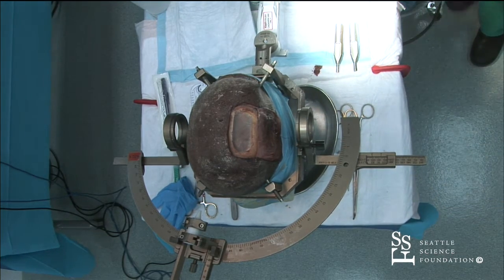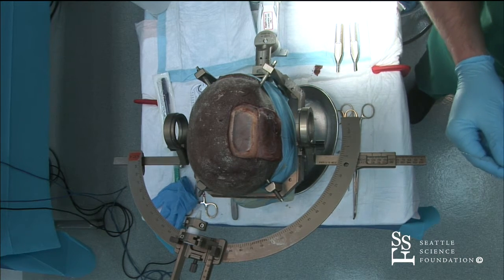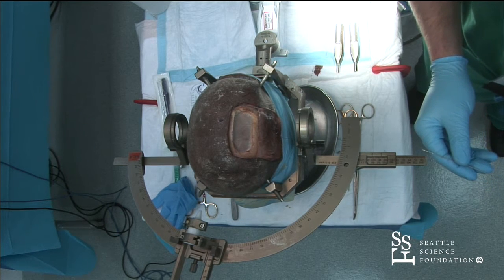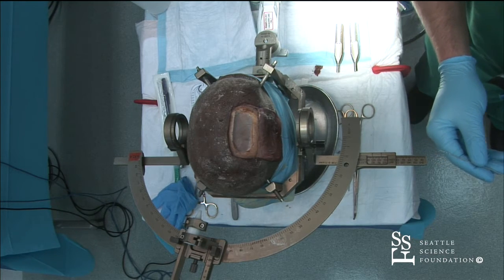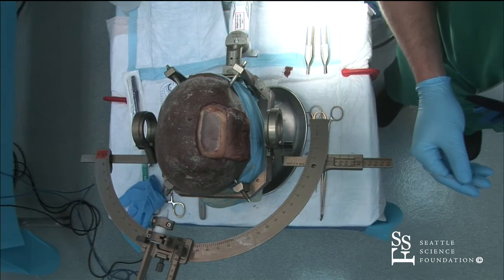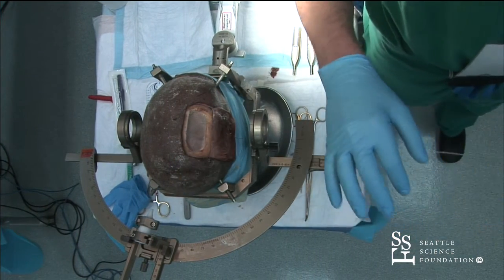There are only 2 electrodes that can be implanted with the RNS or hooked up to the RNS, but oftentimes people will put in even 4 electrodes and then only hook up 2, and that way if one of them isn't working, isn't on the onset area, and you want to plug in a different one that you've already placed, then it's just a subcutaneous surgery as opposed to going intracranially again.